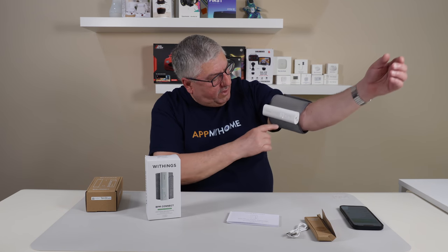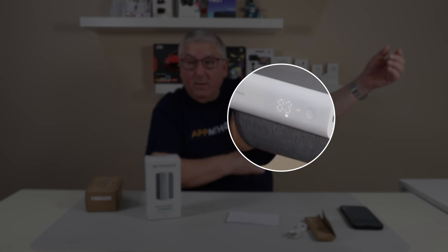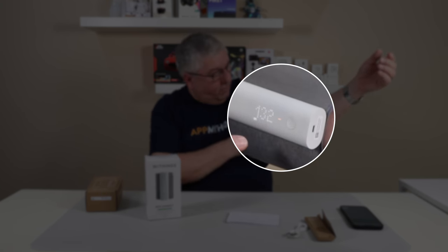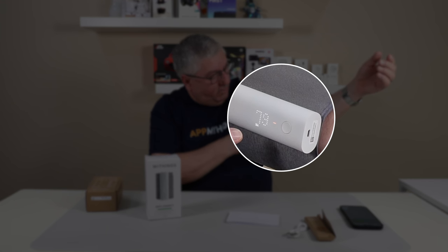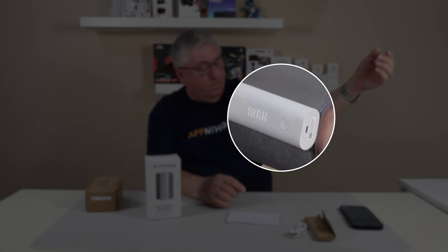It reads out on the screen — 132 systolic and 79 diastolic. So this is really kind of cool. I thought it also does the heart rate: 83. That's pretty good.